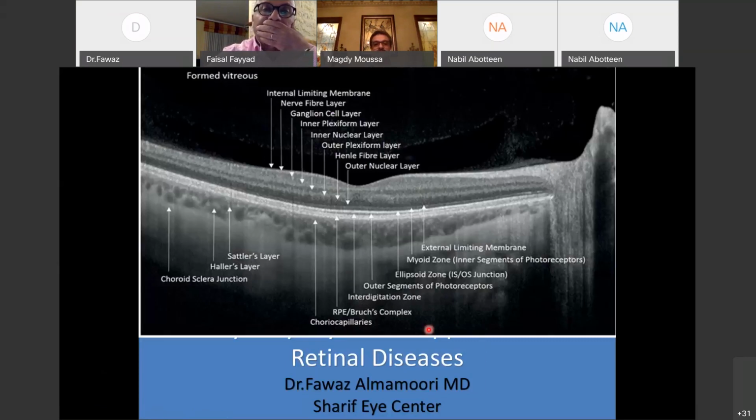I will start the first part of this comprehensive imaging meeting about the basic presentation, which is how to approach OCT layer by layer and how we can analyze the common signs in the OCT in relation to certain retinal diseases. And this presentation will be the basic interactive presentation to the next presentations given by the prestigious speakers.